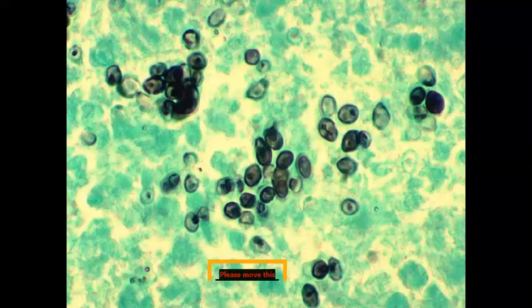Again, this is silver staining, and in silver staining, the background is green, and the fungus is going to highlight as black.